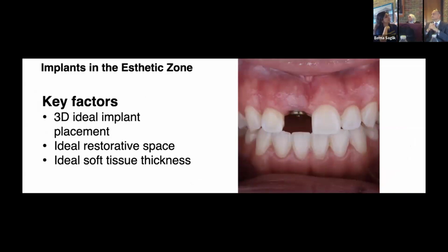What was the study that showed long-term cracking will occur in zirconia? I don't have it on top of my mind, but I can get it for you because this is in my discussion, my paper that I submitted. There are a few studies I can show you that basically say when you sandblast it, it decreases the longevity. I'd like to see those. Yes, okay. I have them on my laptop.